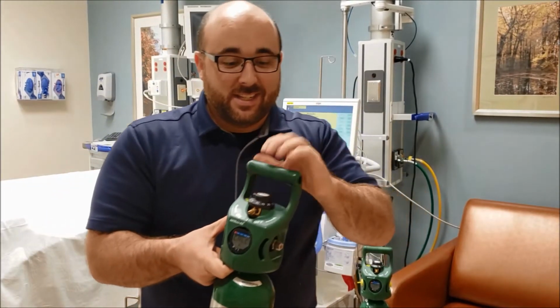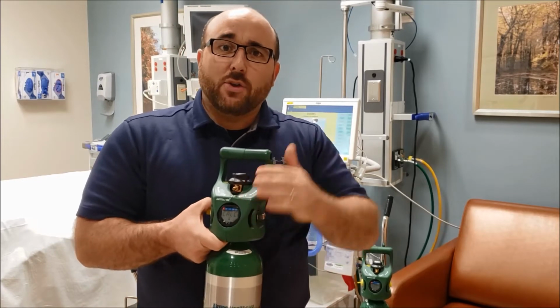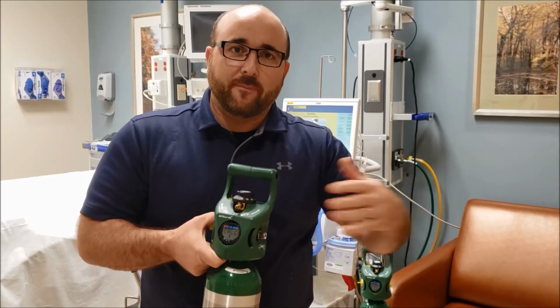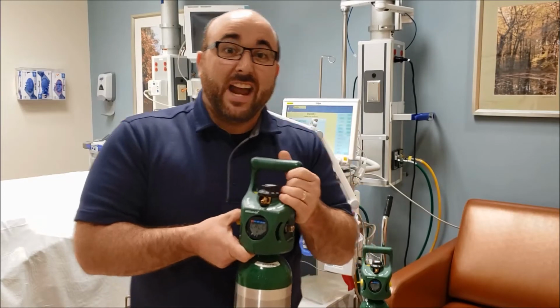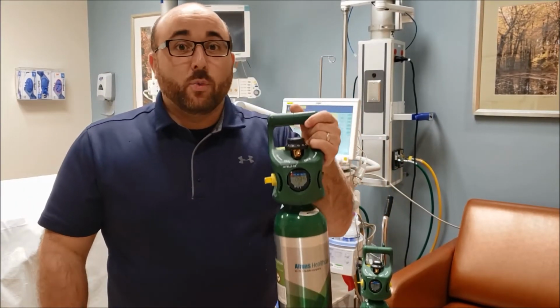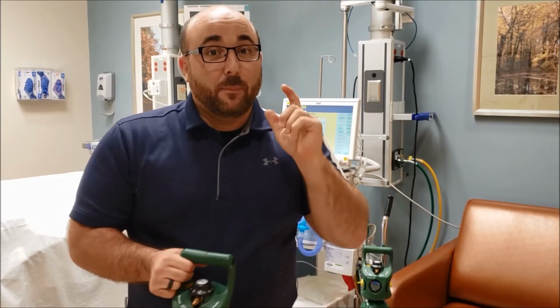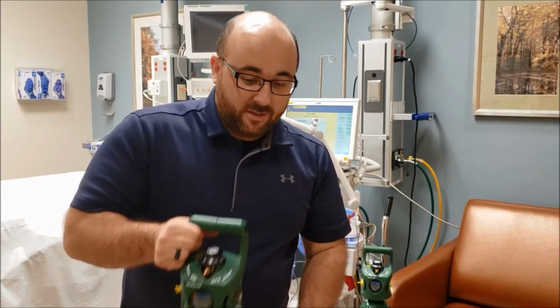The key is, of course, keep it very secured. Make sure you use these tanks until they're really, really low and then return them, so we can use much more of the oxygen out of these tanks. But it's a big patient safety initiative. We're the first in Indiana to use it here at Union Hospital. Super excited about it. It'll be up in Clinton the week after it's here. See ya.